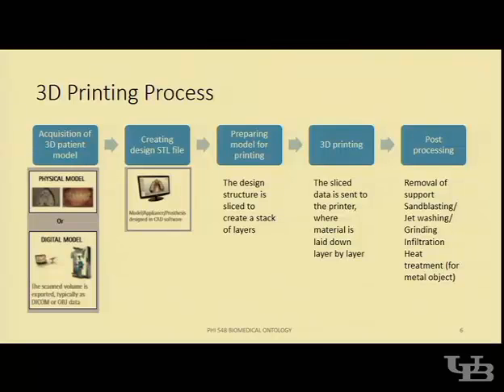And finally, once they have finished the 3D printing process, sometimes they need to carry out several post-processing activities for the finishing of the product. Sometimes they need to remove the support, sandblasting, and so on, all of those processes are involved.